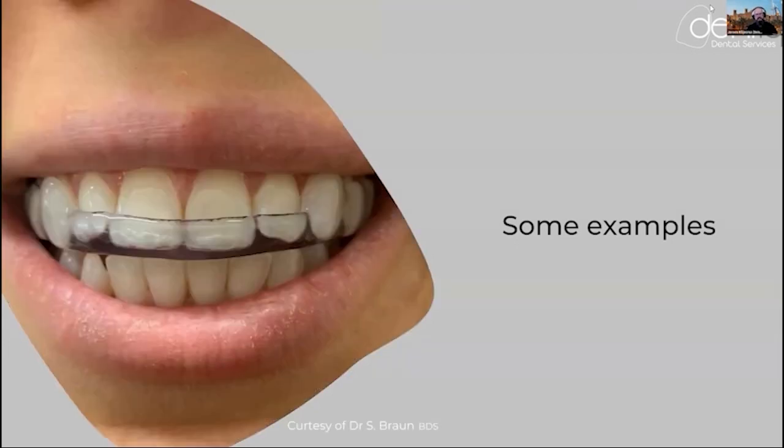Another example, and this is not a class 2A but class 1, is a splint. It's a combination of a Michigan splint, but it just fits. This is, for example, with Keystone Soft. I love that material because when it reaches body temperature, it removes any fitting stress, so it's very comfortable for the patient to wear.